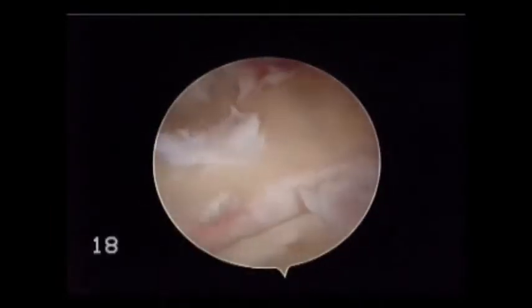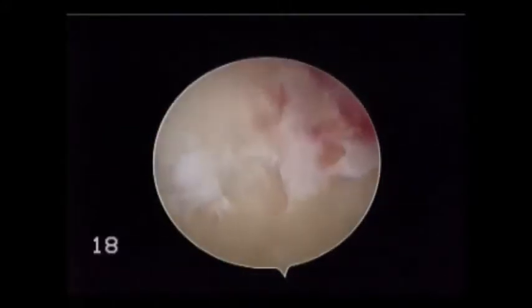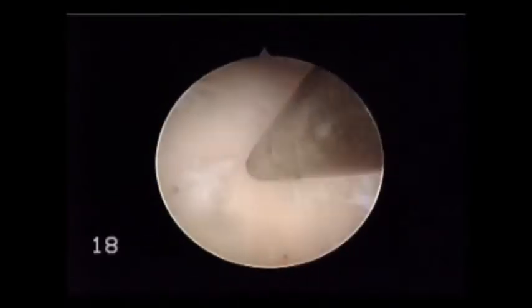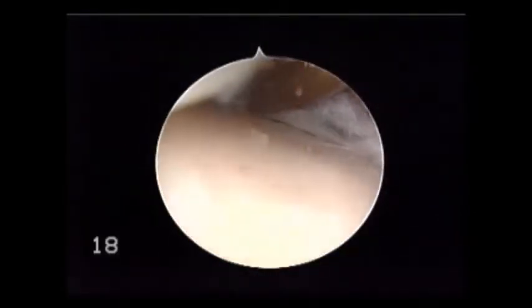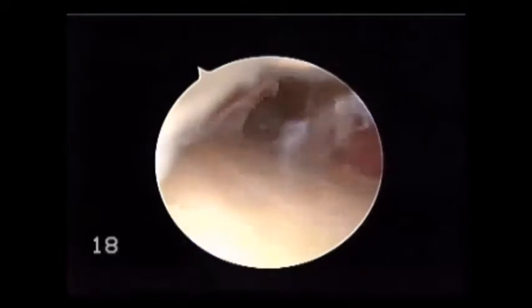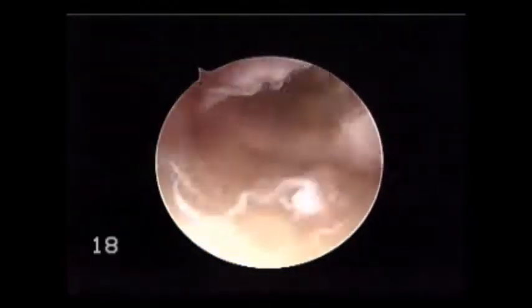This same metal trocar technique can be used in the posterior compartment in this same patient, as shown. We insert the metal trocar into the area of the olecranon fossa and then, using the arthroscopic camera, we follow this metal trocar proximally to the origin of the posterior capsule. We can likewise elevate and release the posterior capsule, just as we did on the anterior compartment on the anterior humeral surface.